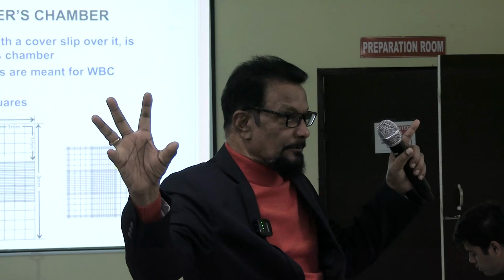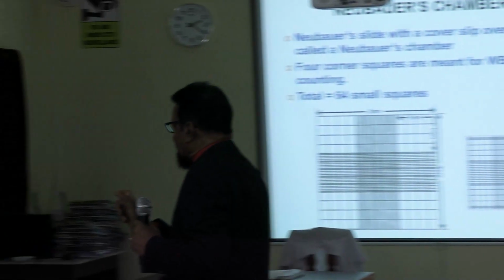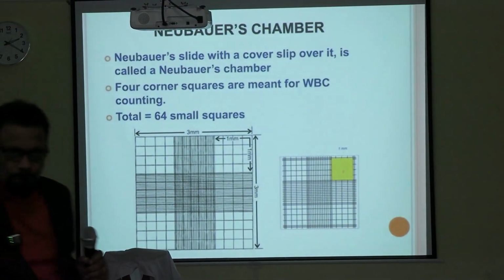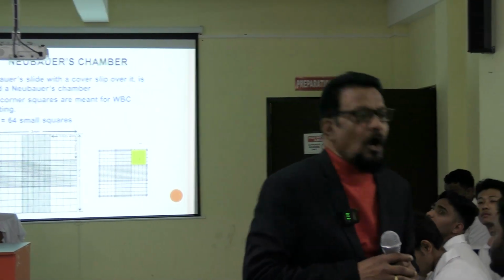So this area contains this mass of WBC. What is the value to be given? Say total 1, 2, 3, 4. 160. Total value is 160. Now, what is the value per cubic millimeter? The number of WBCs is 160 among these 4 in total, all the 4 quadrants.